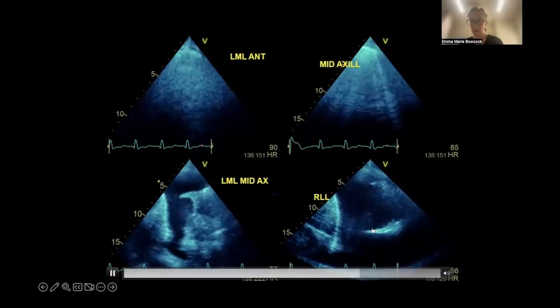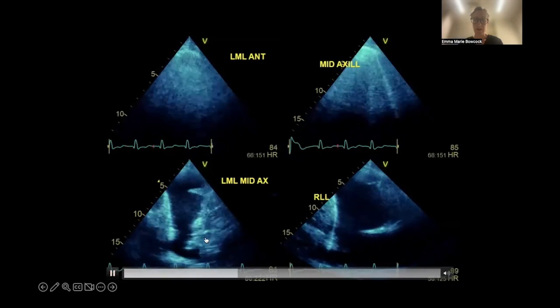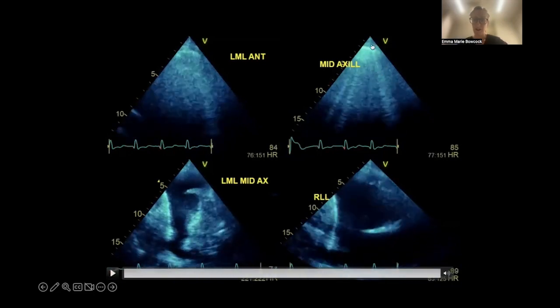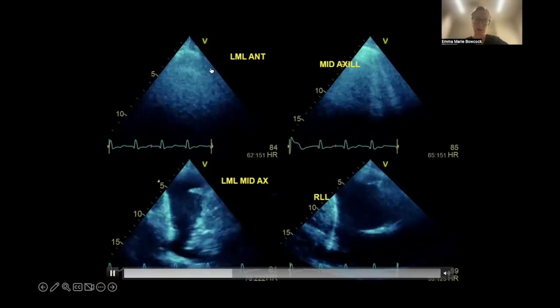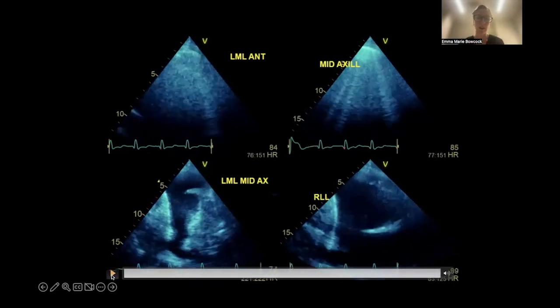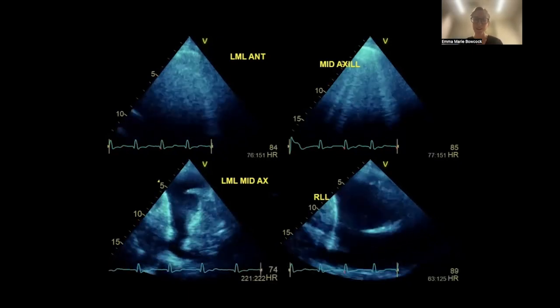Yeah, nice. And this is a little patch of collapsed lung on there, and here as well. Yeah, you can definitely see more than 3 B lines here. Those sort of rocket lines going all the way from near field right down to the end of the sector. I'm not so sure on this one. Maybe there's confluent B lines, and that's why we're not seeing that lovely separation. Does our respiratory consultant lung expert want to chip in on this?